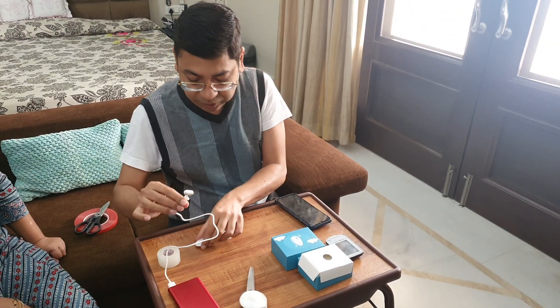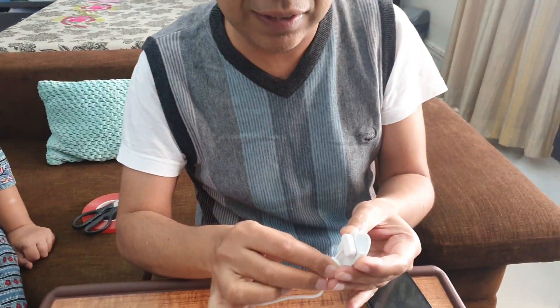So this is the sensor and this is a small charging cradle that comes with it. It attaches magnetically, and once it is stuck you will see it blink red.